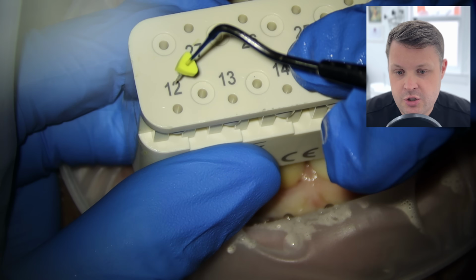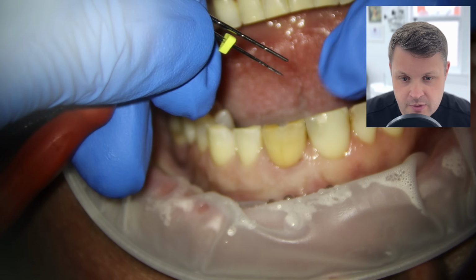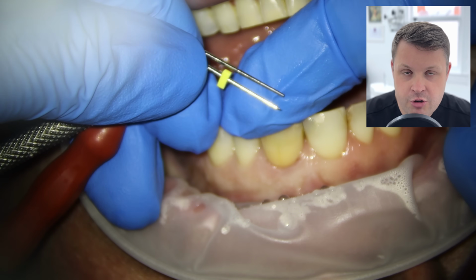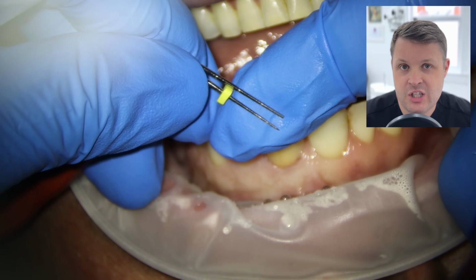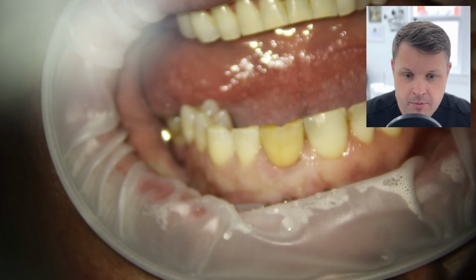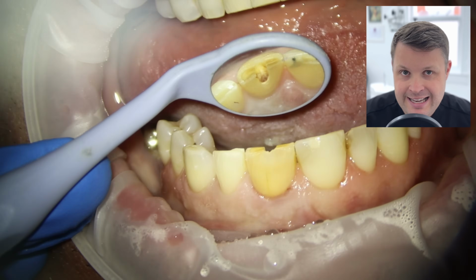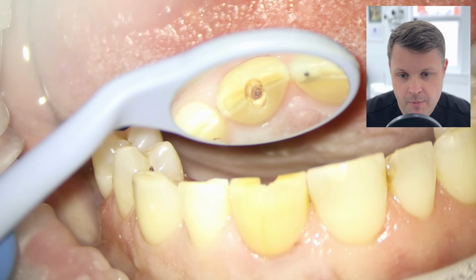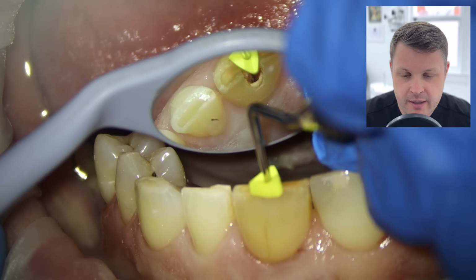And now what I need to use is a thinner gauge tip here, because I am using these needle-tipped ultrasonic instruments, and they are creating a small hole. And the Mach 2 plugger, as you can see here, is quite thick. So I'm using a DG16 endodontic probe with a rubber stopper on just to see if we're at the right depth. And when we place this DG16 with the stopper on, we can see here now that we're around the area of the right depth.